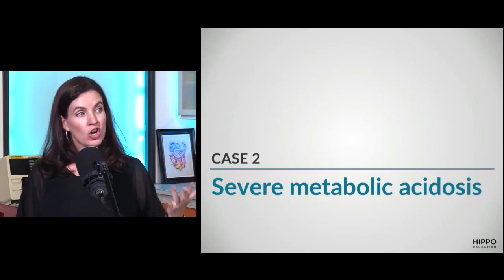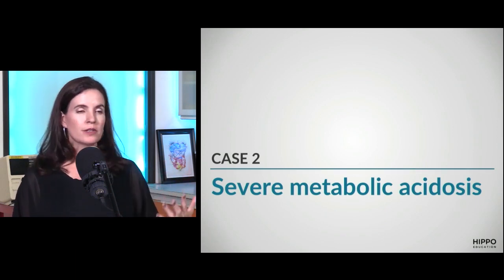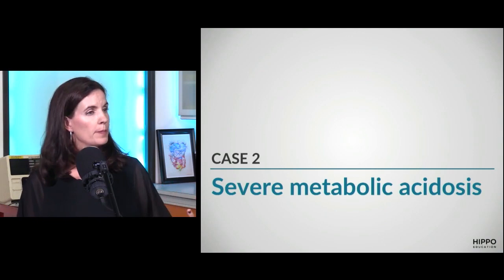And guys, you will have heard people say, don't intubate the DKA patient or don't intubate the aspirin overdose. Why do people say that? Just like case 1, it kills. They have to breathe really, really fast to breathe off their CO2, and we're not matching it. Awesome. If they're paralyzed, they can't breathe at all. You're right. And then they're no longer compensating. So let's walk through this in a case to make sure it's clear for everybody.